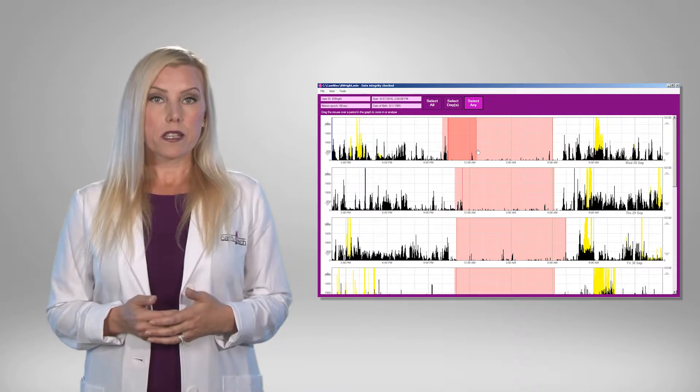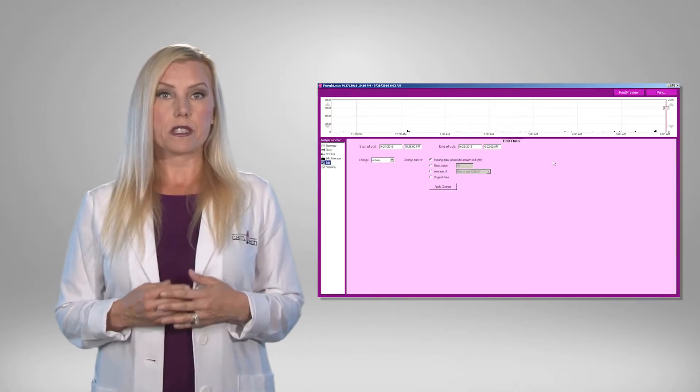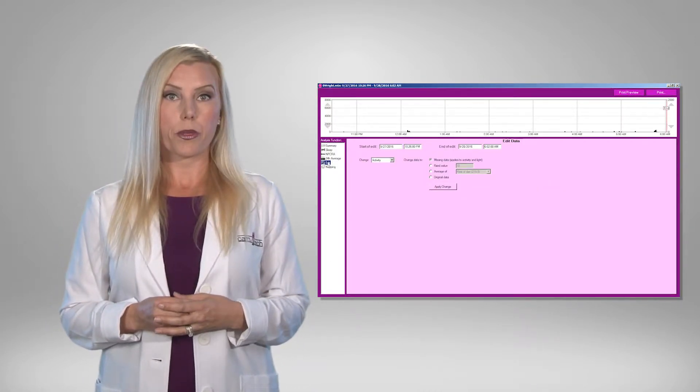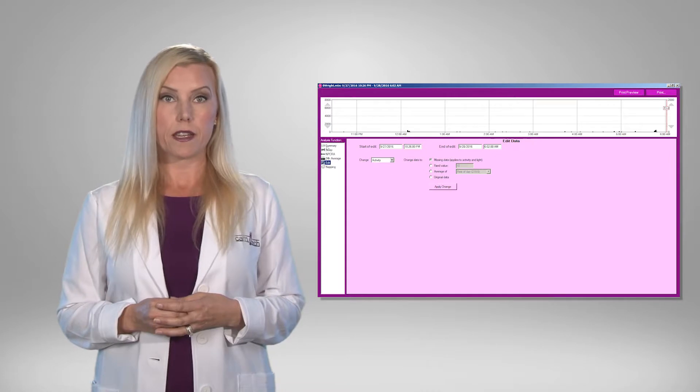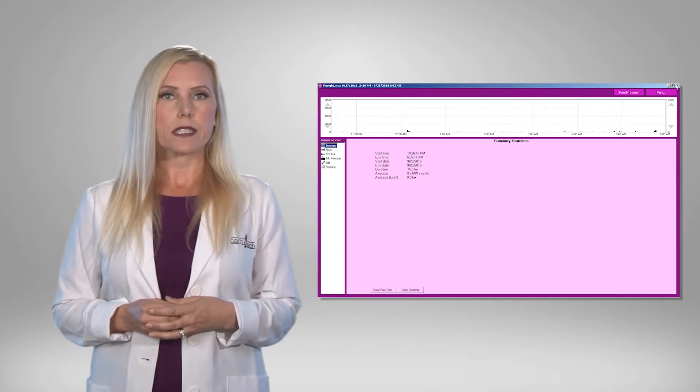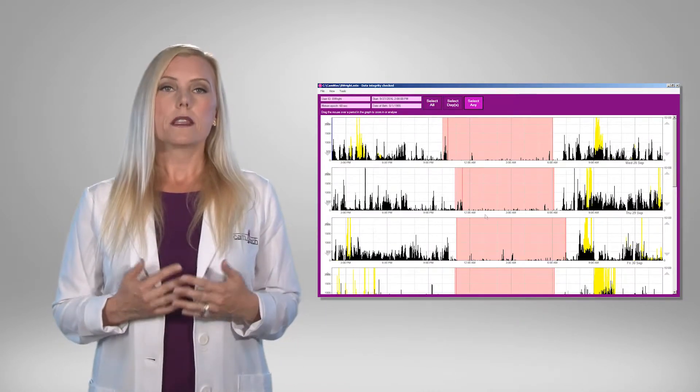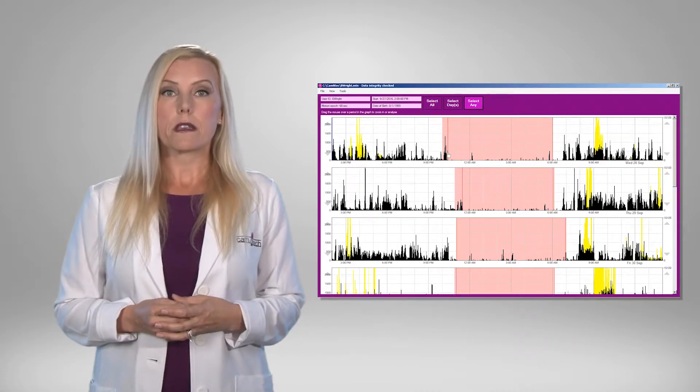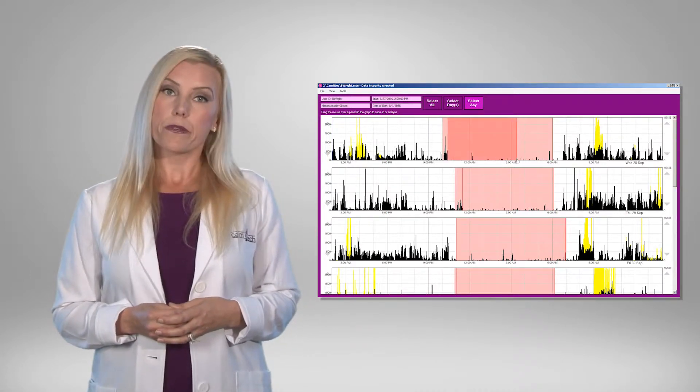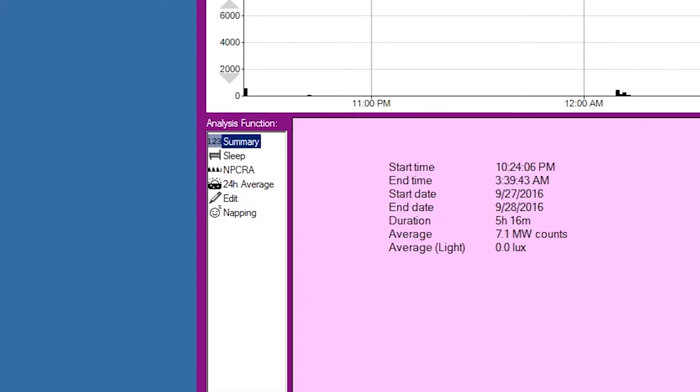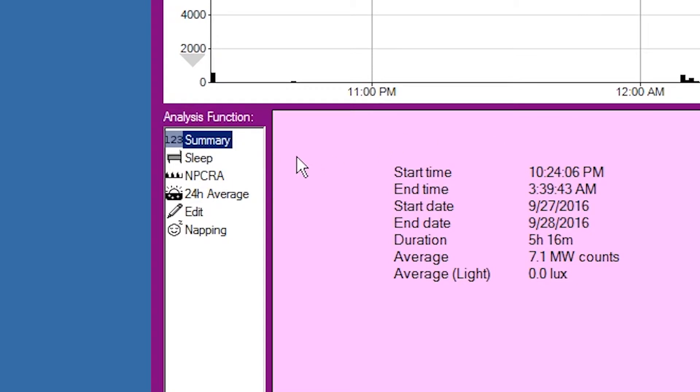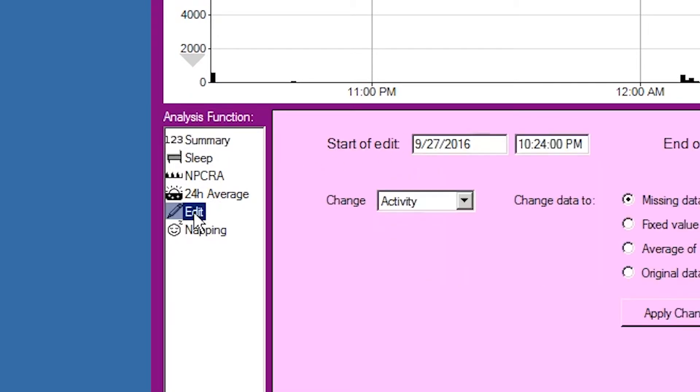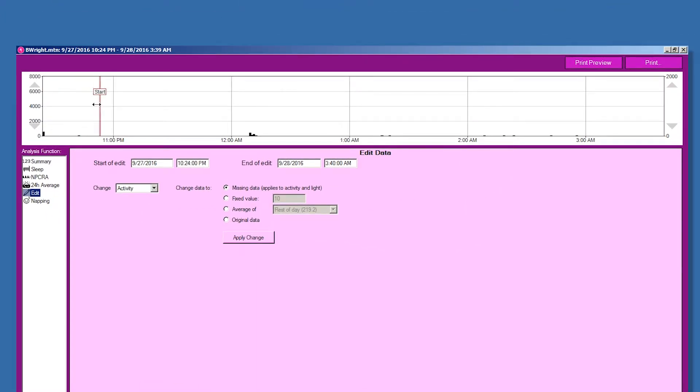It is possible to edit periods where if it is suspected there is a problem with the recorded data and to change or remove the activity during that period. This may be necessary where, for example, the watch was not worn for a period. The edit function may be accessed by selecting a period for analysis, then selecting the edit analysis function from the list in the bottom left of the window.